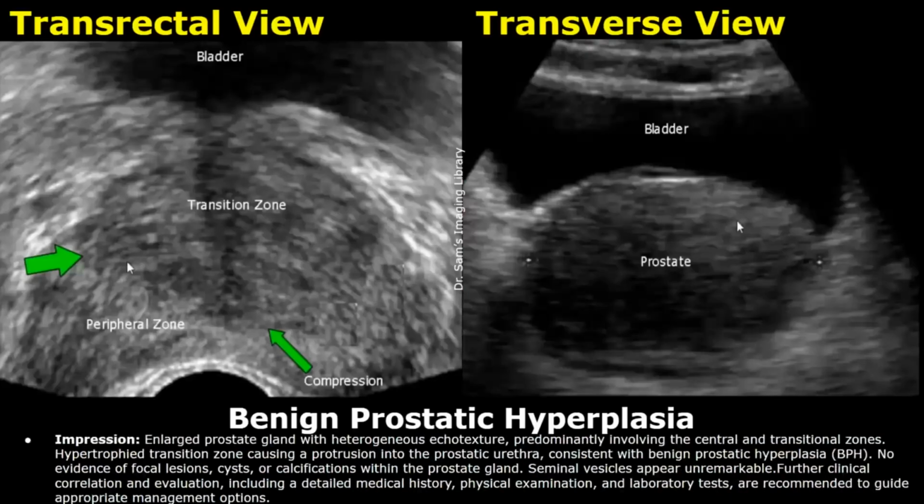All these findings are written in the impression, and you can end the impression with further clinical correlation and evaluation, including a detailed medical history, physical examination, and laboratory tests are recommended to guide appropriate management options.